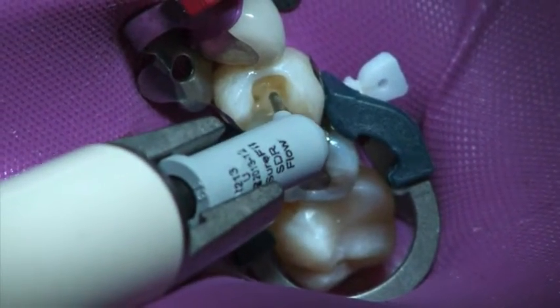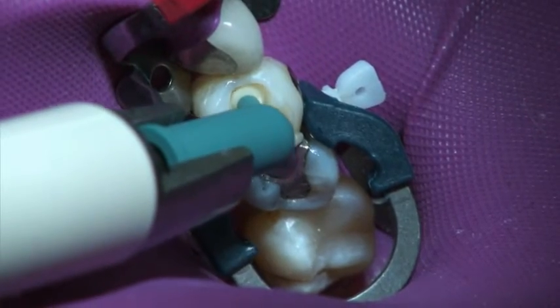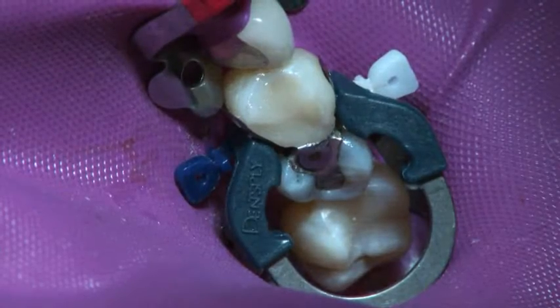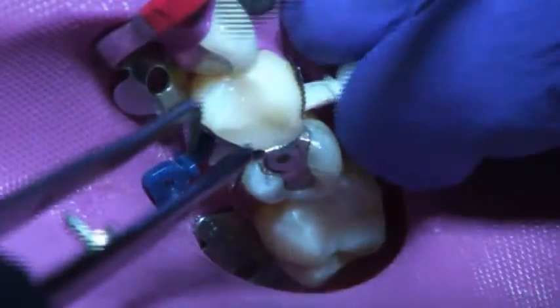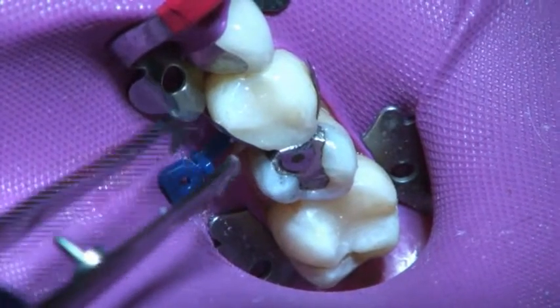The prep box is filled and the material is light cured. Then the restoration is finished with TPH3, which I find is easy to handle and matches the surrounding tooth shades. Now we're ready to remove the matrix. Notice that the band is still snug between the teeth, maintaining its contacts throughout the procedure.